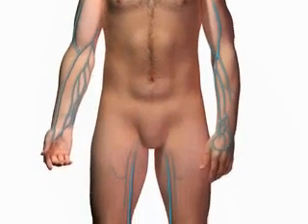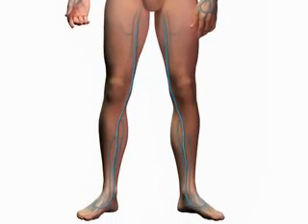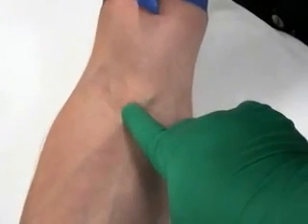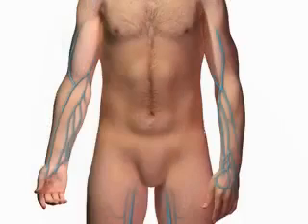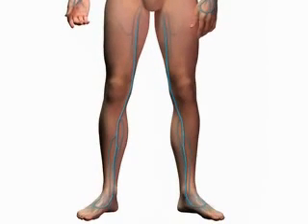The venous system of the lower extremities consists of the greater and lesser saphenous vein, cannulated in acute situations, as it accommodates large bore catheters and may be easier to cannulate. When upper extremity veins are inaccessible, the dorsal veins of the foot or the saphenous veins of the lower extremity may be used.